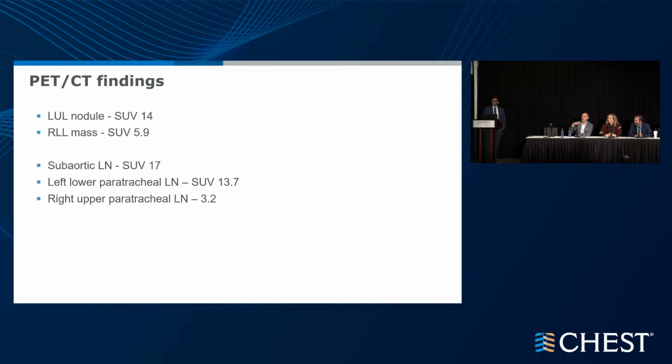It's so pathology dependent that on Monday morning, I pray for certain pathologists. But yeah, Marcus, can I speak from a bronchoscopic third world country like Europe? That's a continent. Not many robots and so on. Does the practice in the States now differ between your center of excellence and other centers that may not have robotic bronchoscopy? So in our center, what that patient would have, similar to what Tim said, is one needle for 4R, 1 needle for 4L, under conscious sedation. Depending on what we find, we just do a fluoroscopic guided biopsy, and presume the lymph nodes belong to someone. Now, I don't know how that fares.